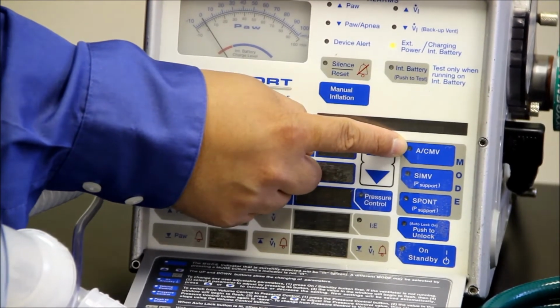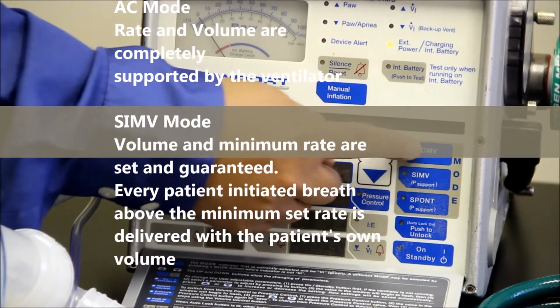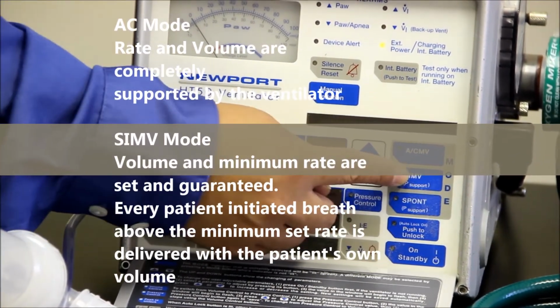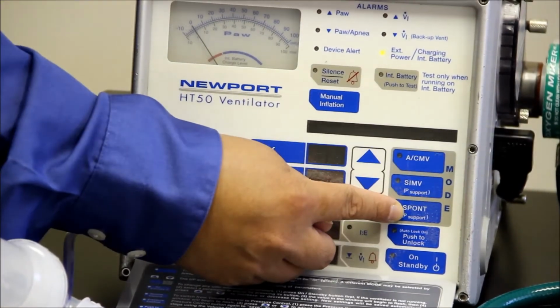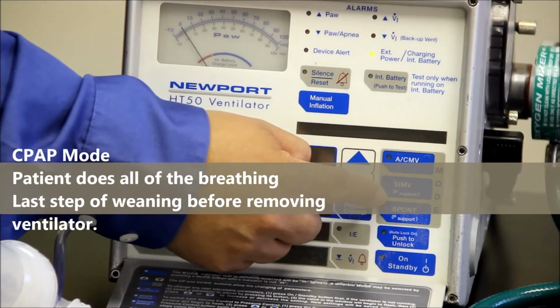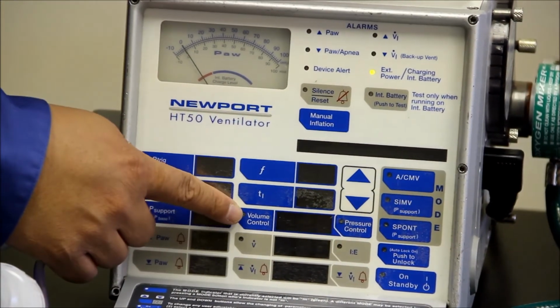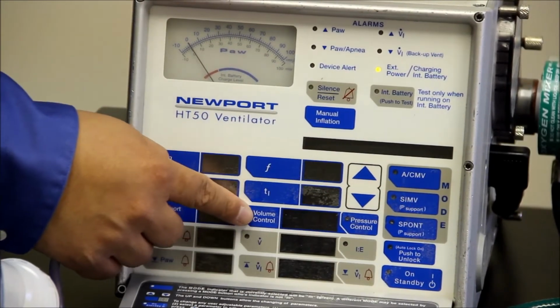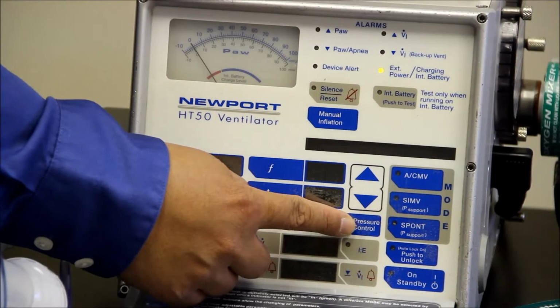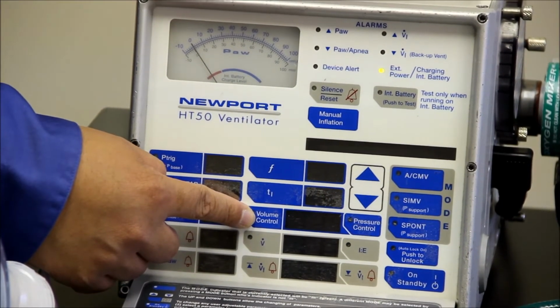This is the mode that we can provide to our patients. As you can see, ACMV, this is the assist control mode that I was talking about right here. This is the SIMV mode, the synchronized intermittent ventilation mode that I was describing, and the spontaneous or CPAP mode. So these are the three modes of ventilation that we can provide to our patients. And here we can either control the patient's breathing by volume or by pressure.